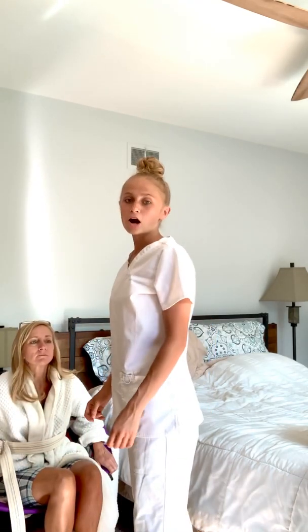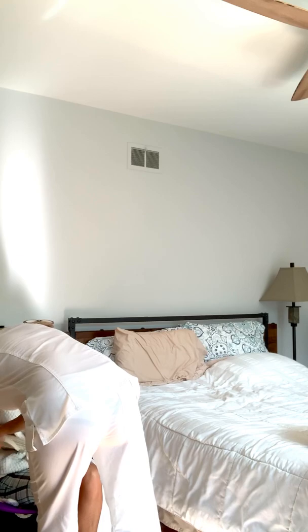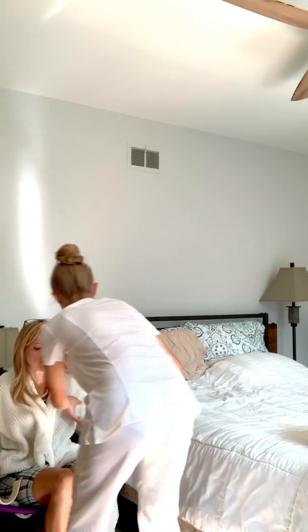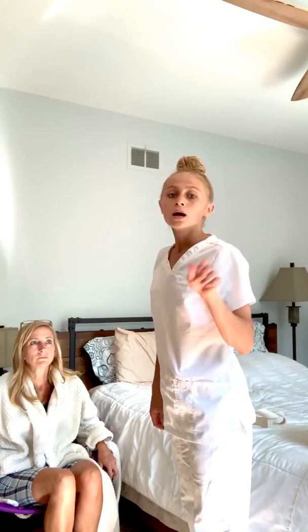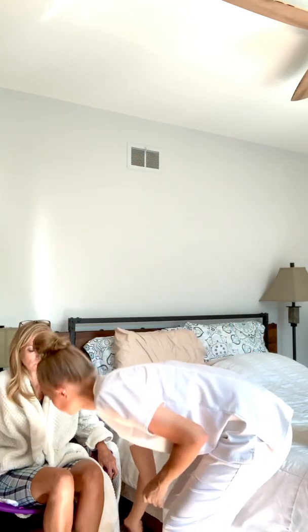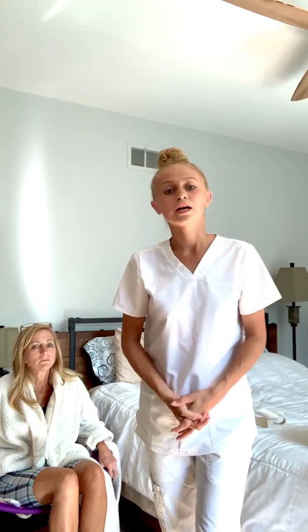So now I can take off my patient's transfer belt. And then I am also going to be putting the wheelchair foot plates down as well. And now I would just provide for comfort, and I would do a safety check around the room. I can unscreen my patient, and then I could wash my hands, and then I would report and record my observations to the nurse. Thank you.